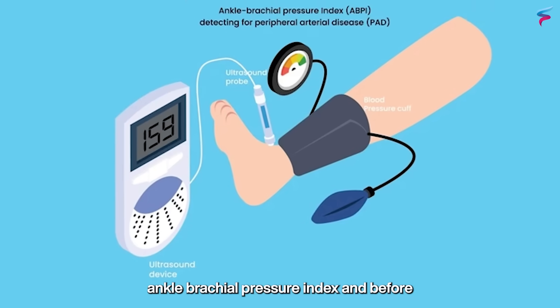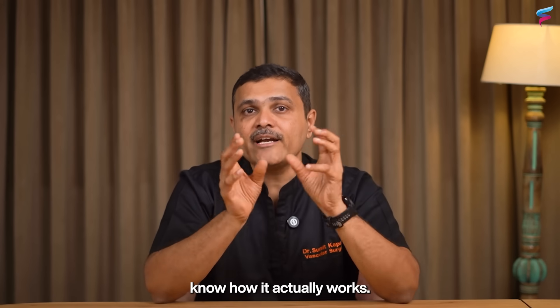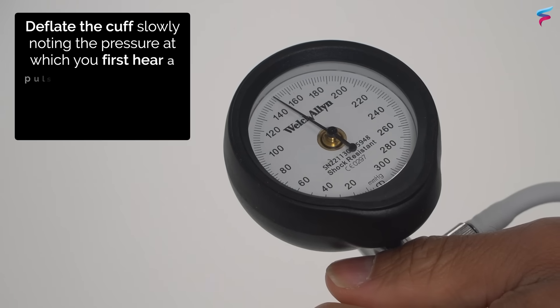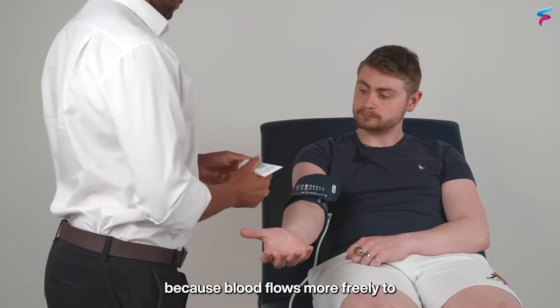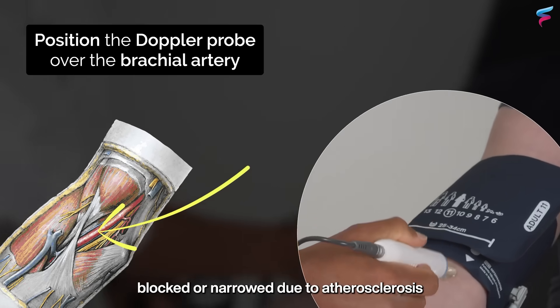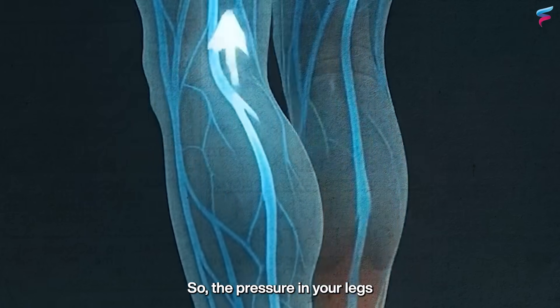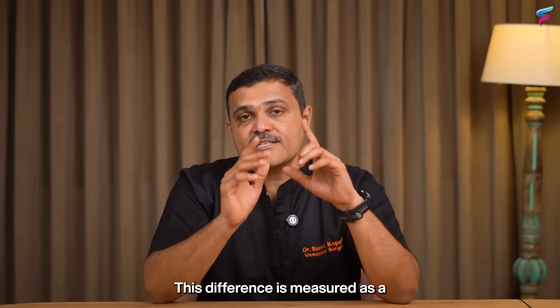ABI is also called the Ankle Brachial Pressure Index. In simple words, it compares the blood pressure in your legs or ankle with the blood pressure in your arm. Normally, the pressure in your legs should be equal to or slightly more than the pressure in your arms because blood flows more freely to healthy arteries. But when arteries are blocked or narrowed due to atherosclerosis and plaque, the pressure in your legs starts becoming lower.